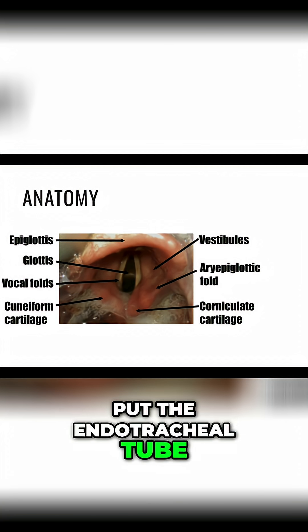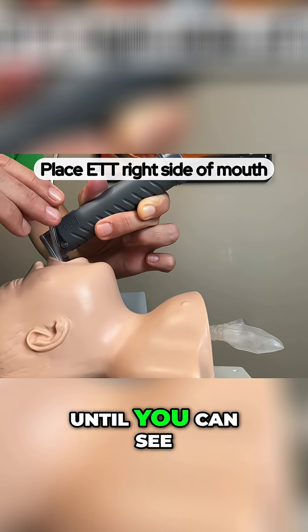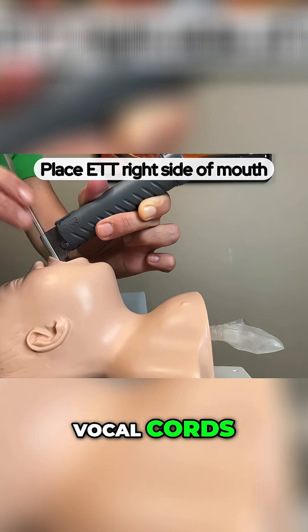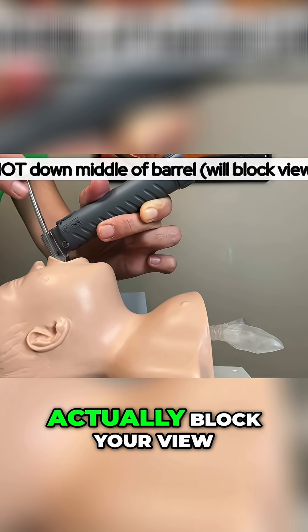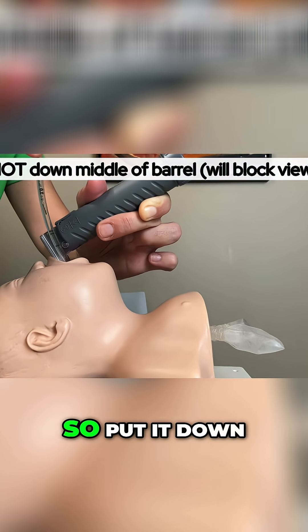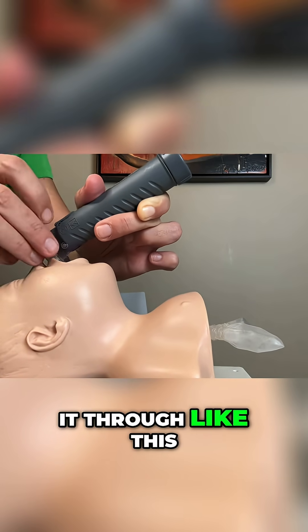put the endotracheal tube in from the right side of the mouth and thread it down until you can see it pass through the vocal cords. Don't put it down the middle of the blade because that will block your view of the vocal cords. Put it in from the side of the mouth and thread it through.